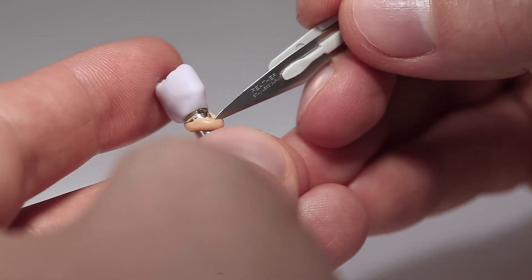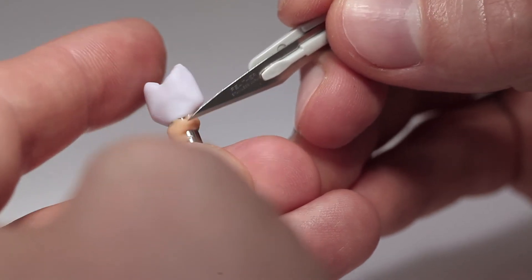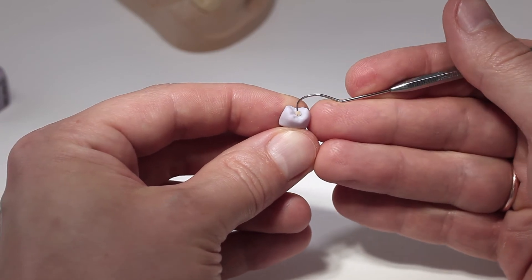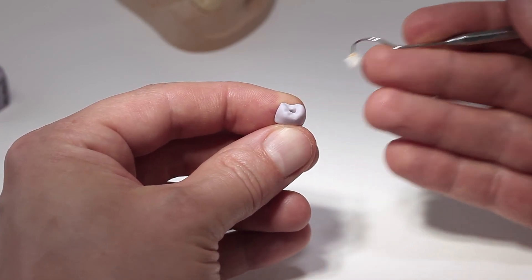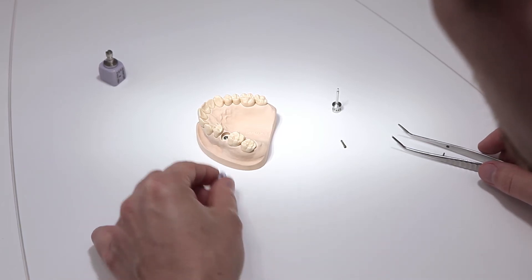Carefully remove protruding excess material using a suitable instrument such as a scalpel. Also remove the foam pellet and excess Virtual extra light body fast set from the screw channel. You are now ready to carry out the clinical try-in.